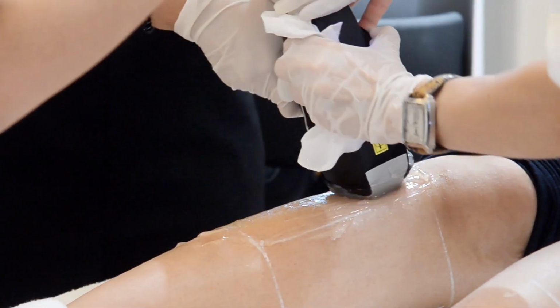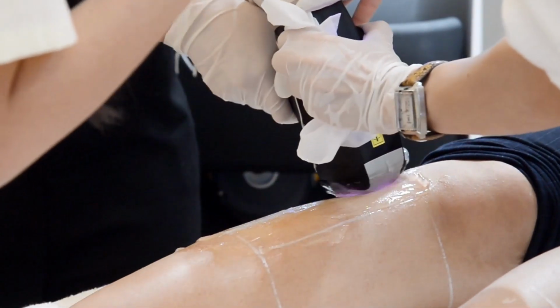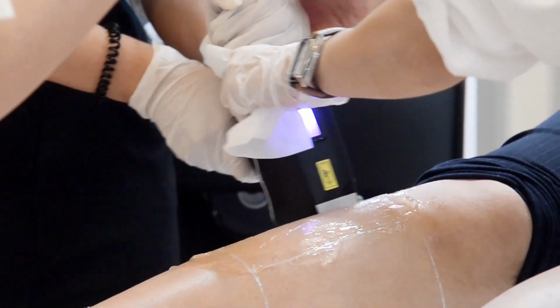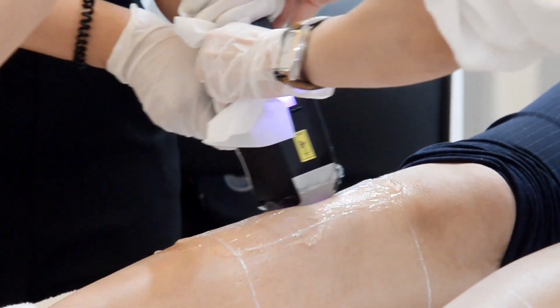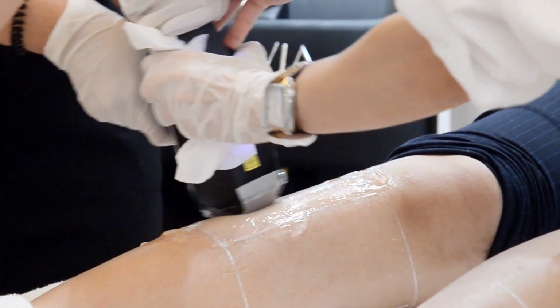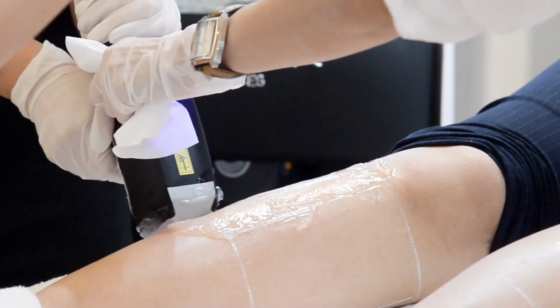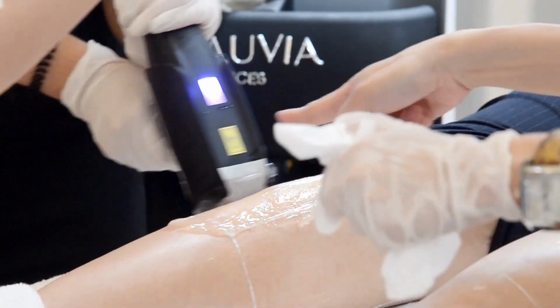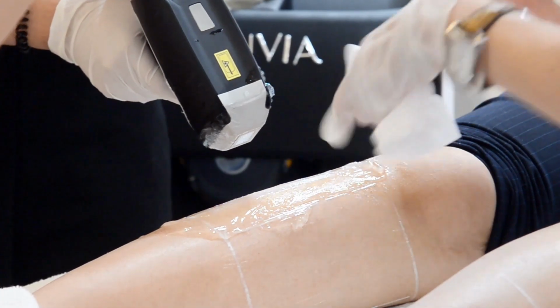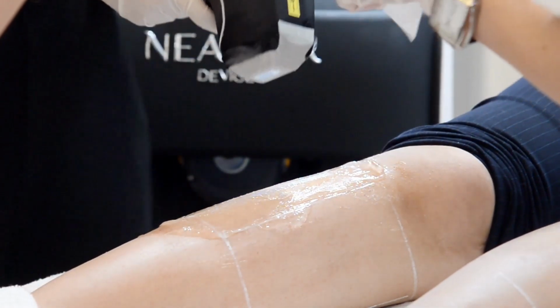Continue on, don't stop. Then you move back down. You can only stop when the device gives you the alert. Okay. Continue the whole area. Okay, so the device alerted that this area is completed. So then you can move on to the next area. Okay? All right. Any question?